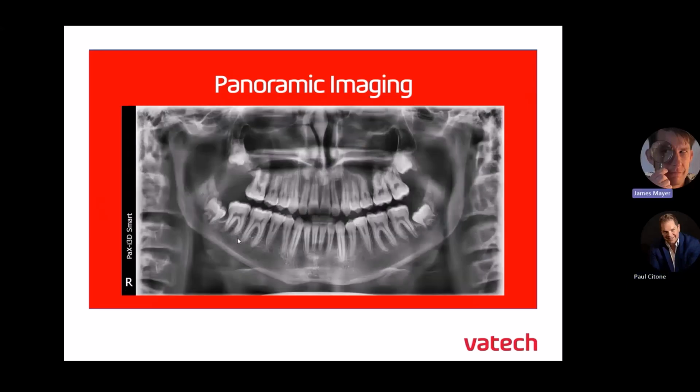So Paul, I think that concludes our review of the panoramic imaging troubleshooting or image IQ. I think the main things are ensuring that we are positioning the patient properly, taking off the jewelry, which should result in a clinically diagnostic image.